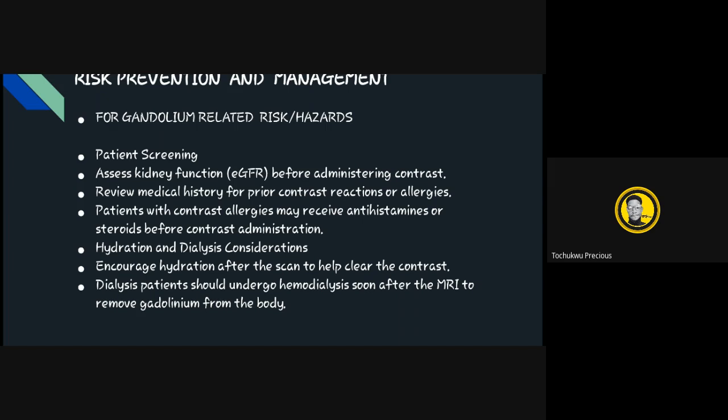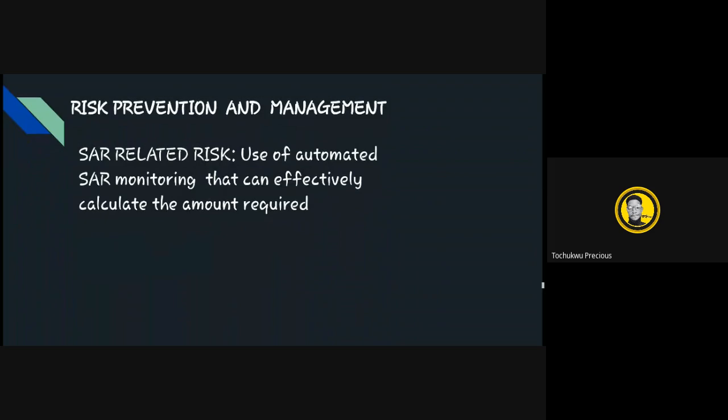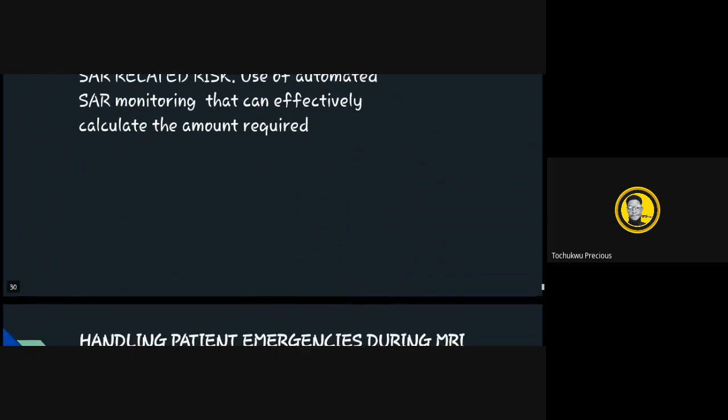That is if the contrast is very necessary and the procedure will not be complete without it. Ensure hydration after the scan. So for all patients, it's important that you advise them to drink water when you get home. So SAR related risks, use of automated SAR monitoring that can effectively calculate the amount required.